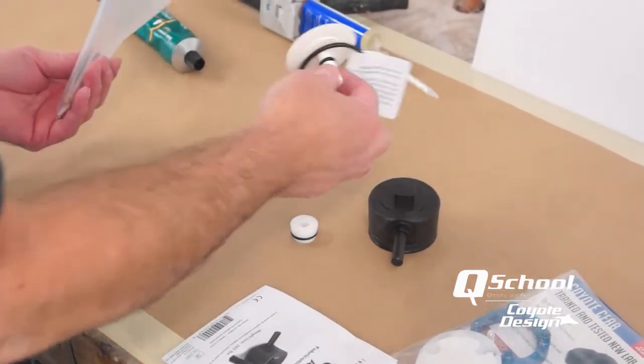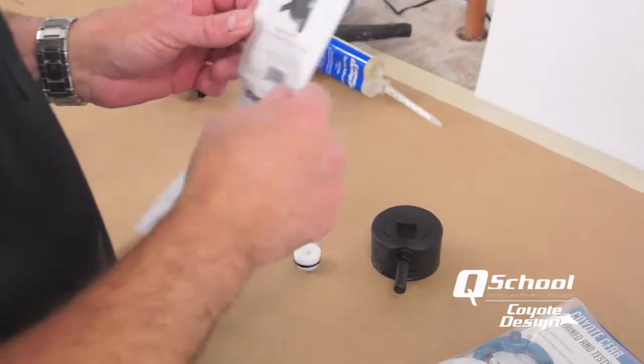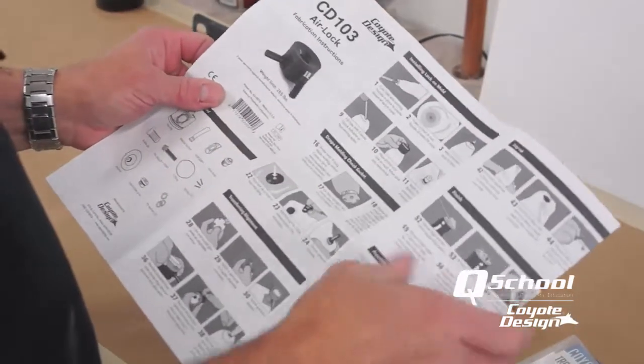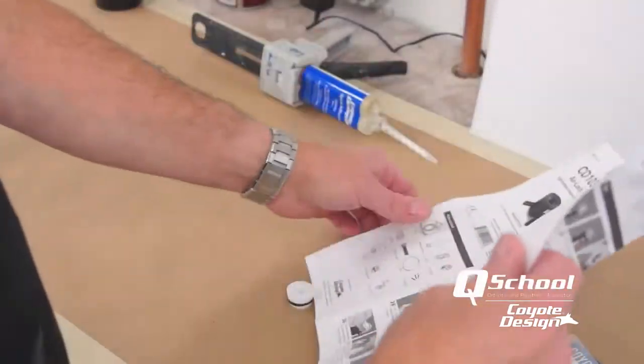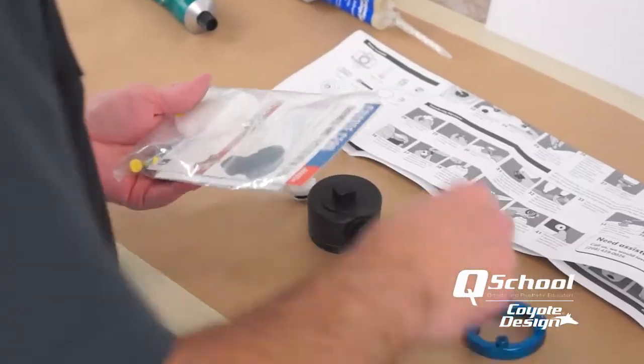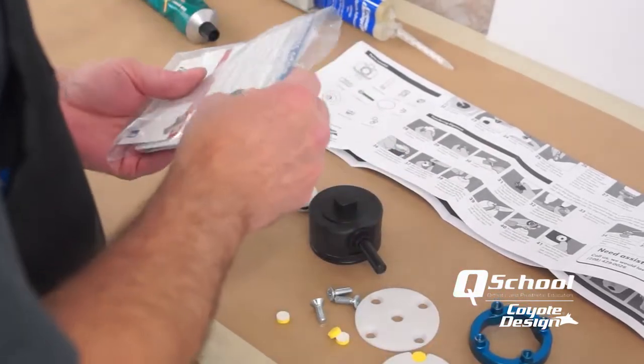Our cast already has an anchor on it, so we won't need that — set that aside. Here's the most important part of the package: the fabrication instructions. Most people wouldn't believe that, but it is true. We'll get our align-4 out along with everything we need.